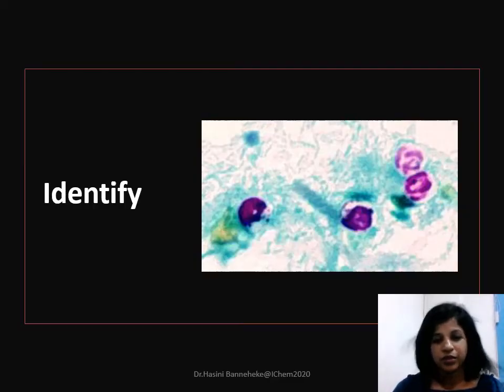So can you see? Can you identify these structures? This is again from a fecal sample. The smear has been stained with modified Ziehl-Neelsen stain. Again, the size is quite important here, but I have not given the size, so you can't consider that factor for recognition, but you can consider the other factors.